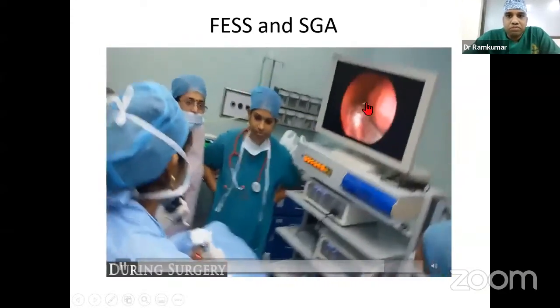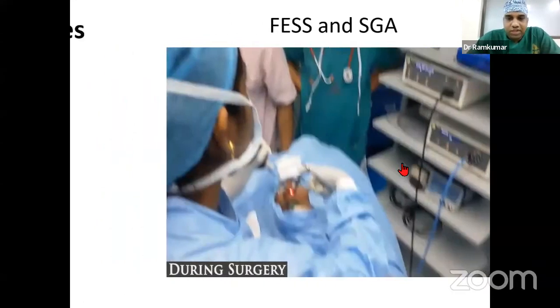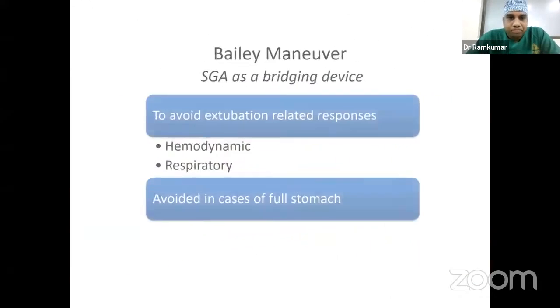Since there is no tube, the hemodynamic response is less, so there's less chance of bleeding. The advantage here is that the airway tube is a little short and the connector is a little bent, so it sits on the chin and doesn't come in the pathway of the surgery or endoscopy.